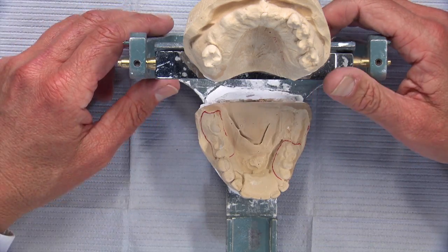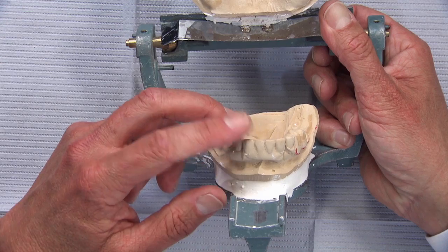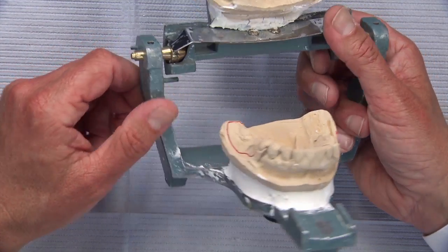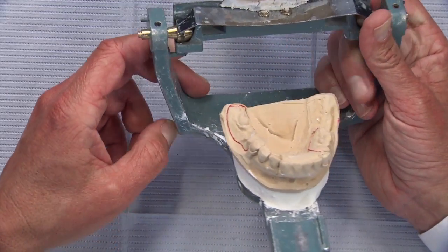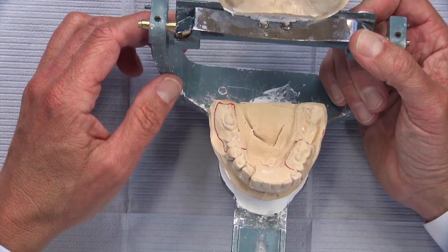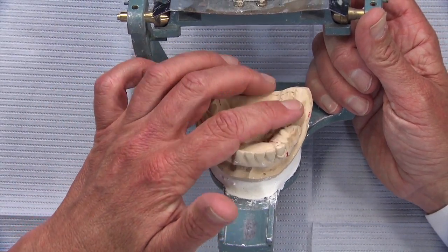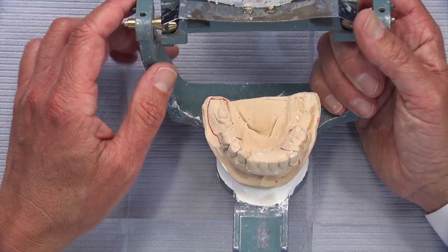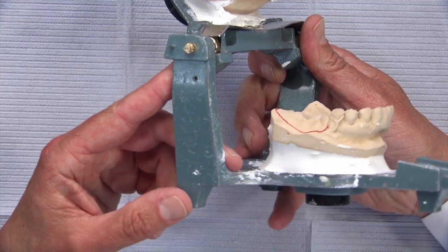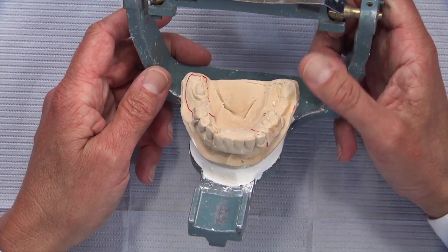So another option would be for the doctor to take a pickup impression with this partial in place and send it all out to the laboratory, and we could pour that, and then we could add new teeth onto both of the saddles, and we could do a wax up on the opposing and get an appropriate plane of occlusion on this lower denture, and then fabricate the upper to that and send them both back to the doctor to have them be delivered at the same time with the occlusion adjusted.